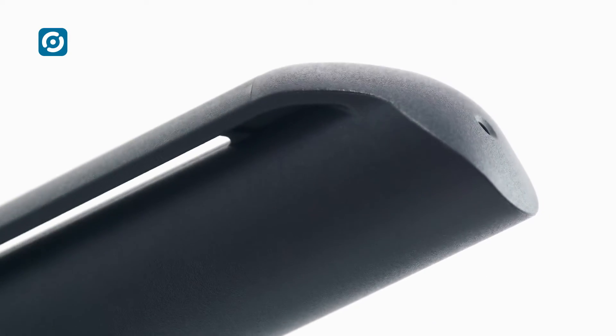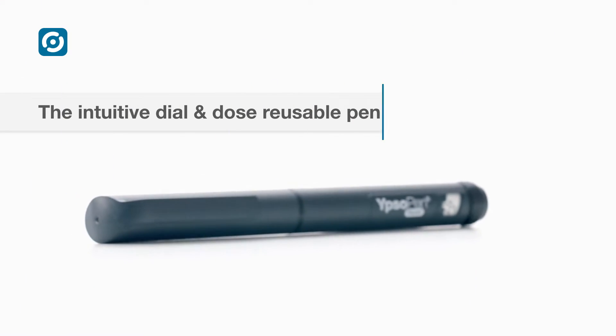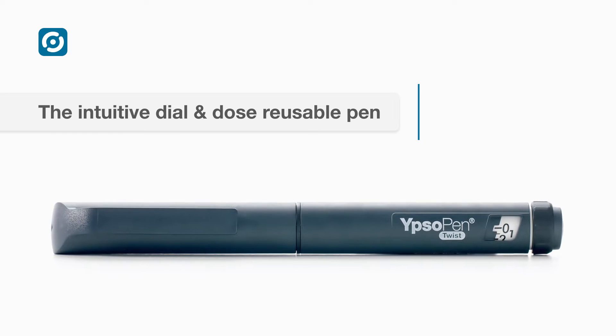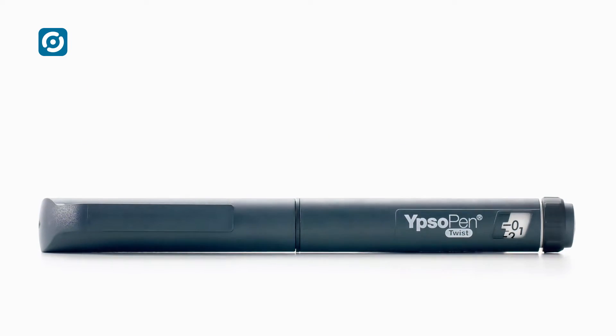Proven and intuitive. Ideal for insulin. That's Ipsa Pen. Ipsa Pen is a reusable insulin pen that competes successfully in price-sensitive markets.